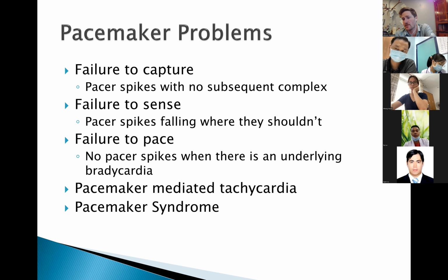And then there's failure to pace. So there's no pacer spikes and there's an underlying bradycardia. We see these patients will be very bradycardic, maybe hypotensive, and they're not even having pacer spikes. Then there's something called pacemaker mediated tachycardia and pacemaker syndrome that we'll talk about.